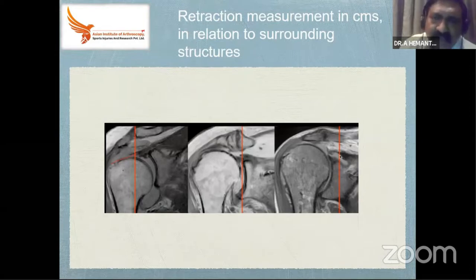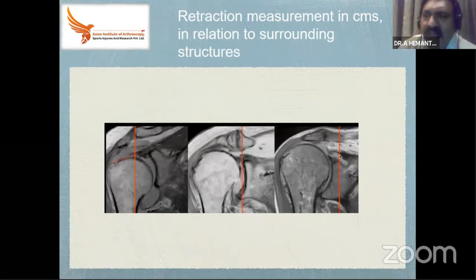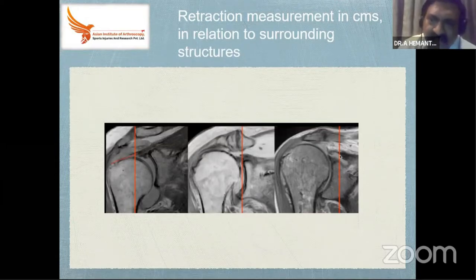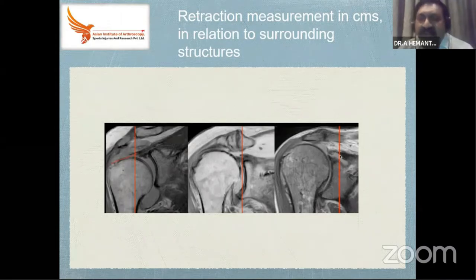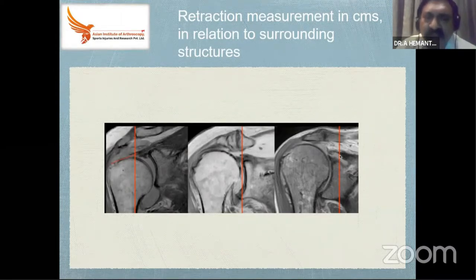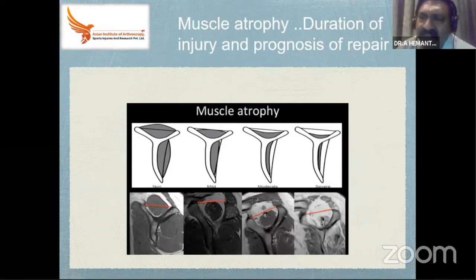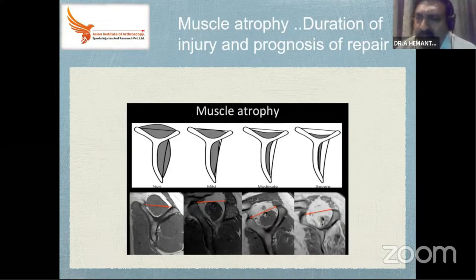When someone asks where the cuff tear is, you can say at the lateral border of the acromion, at the middle border of the acromion, or beyond the glenoid. There may sometimes be a short question about the classification of cuff tears. It is important not only to identify the tendon but also to see the muscle belly — because unlike the knee joint, in the shoulder the muscle belly assessment is prognostically very important.